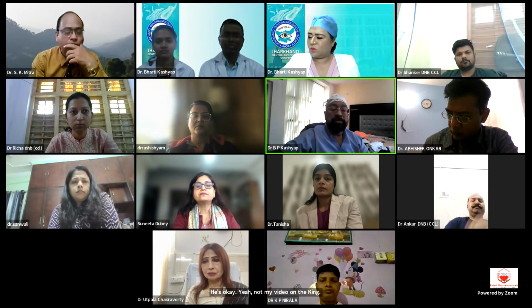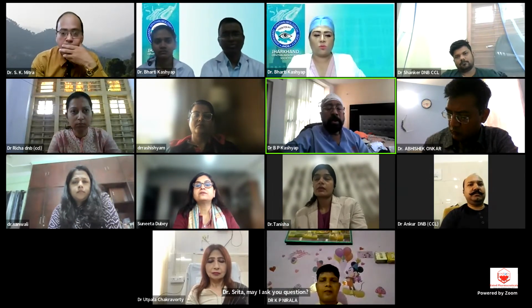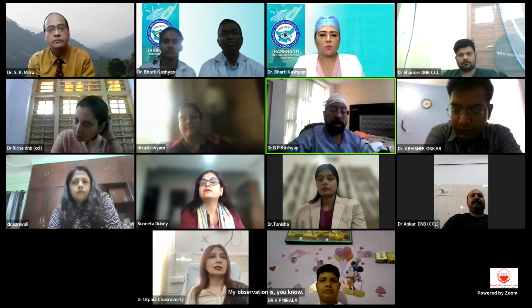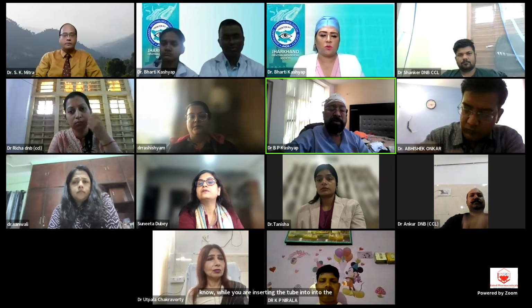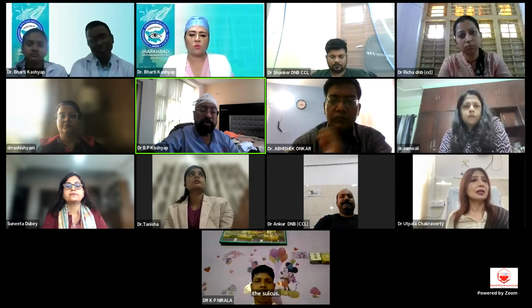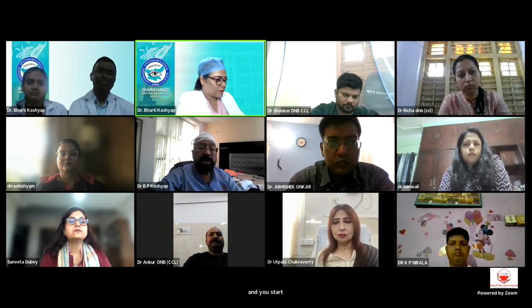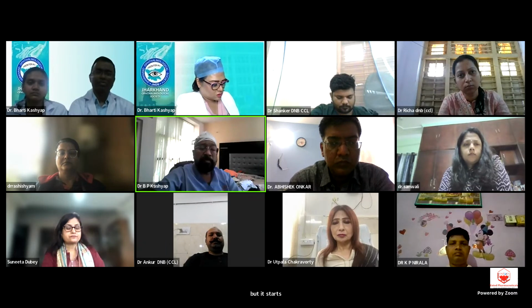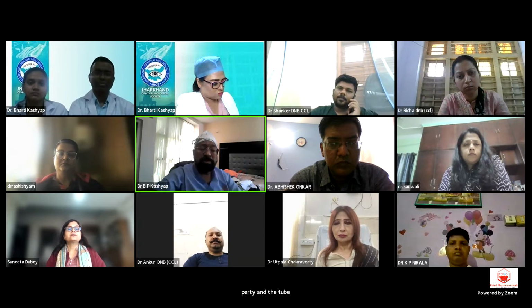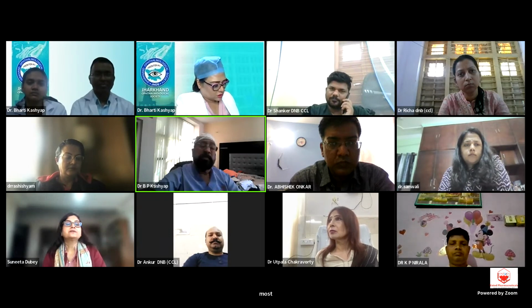Dr. Sunita, may I ask you a question? Yeah, sure. My observation is, while you are inserting the tube into the eye, either in the anterior chamber or in the sulcus, when you hold the tube and start shoving it in, there is always a kinking towards the junction of the main body and the tube. And many times it's very difficult. I think the most difficult part is making the tunnel and putting the tube inside.